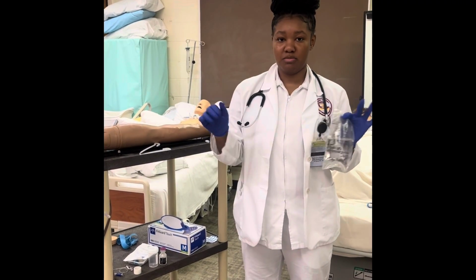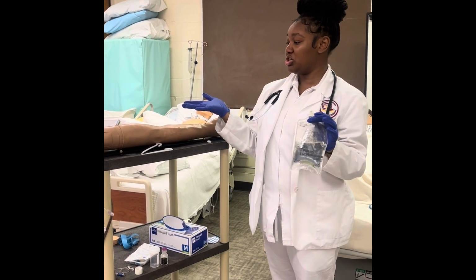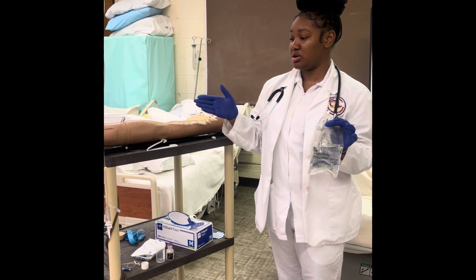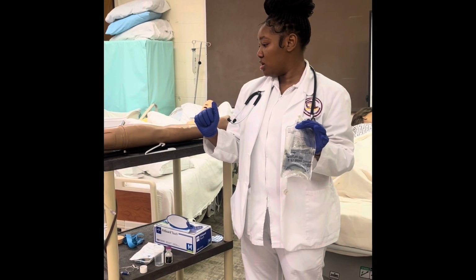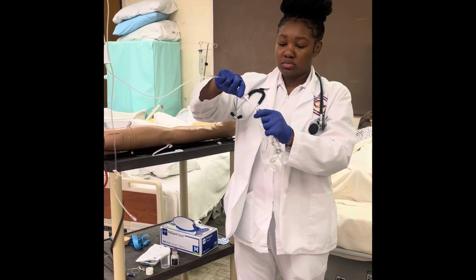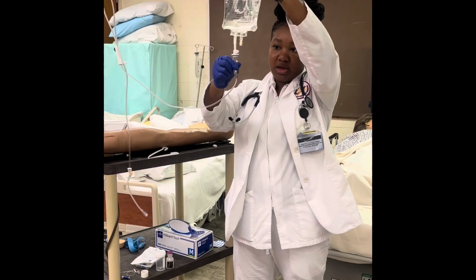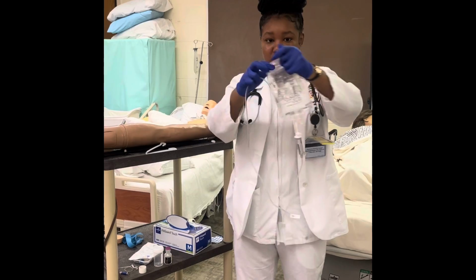Oh, and for video purposes, before I started, I did hand hygiene, put on clean gloves, introduced myself to the patient, made sure I used 2 identifiers to identify my patient, and checked the MAR to make sure this is the correct patient, correct medication, and that there is good compatibility between the solutions and the other medications going. So first, I'm gonna start by spiking my primary bag. I'm gonna push the solution about halfway up to the line, squeeze, and then I'm going to prime and get all the air out of my tubing.